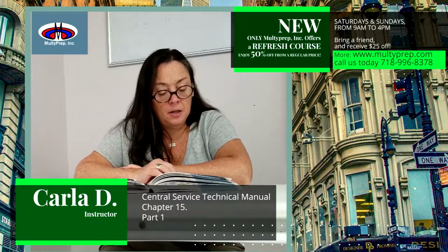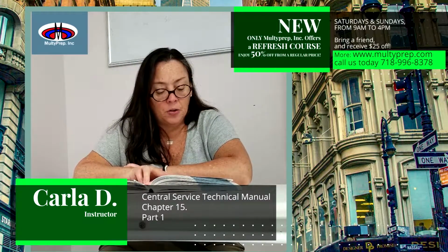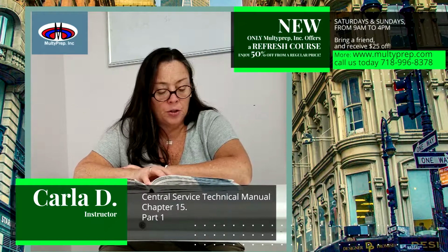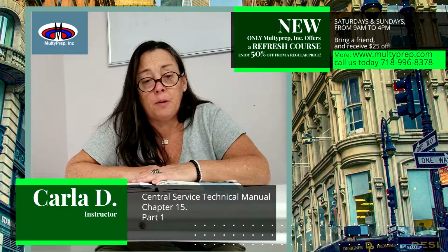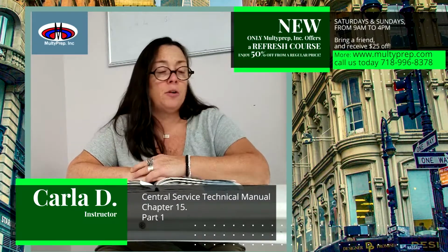Ethylene oxide, EtO. For more than 60 years, EtO gas has been an effective sterilization technology for heat and moisture-sensitive medical devices and surgical instruments. EtO contributed to the development and increased use of delicate, sophisticated surgical instruments that would be damaged in the intense heat and high moisture required for other sterilization methods. See Figure 15.2, which shows an EtO sterilizer.